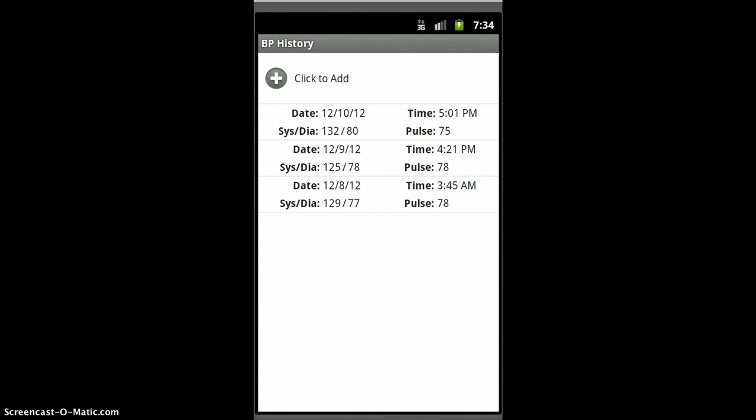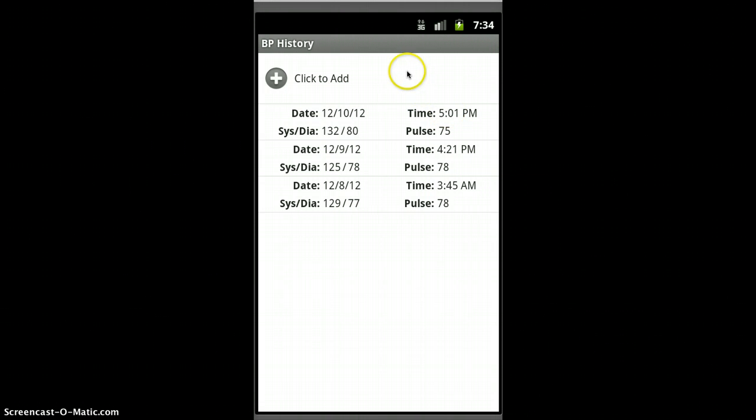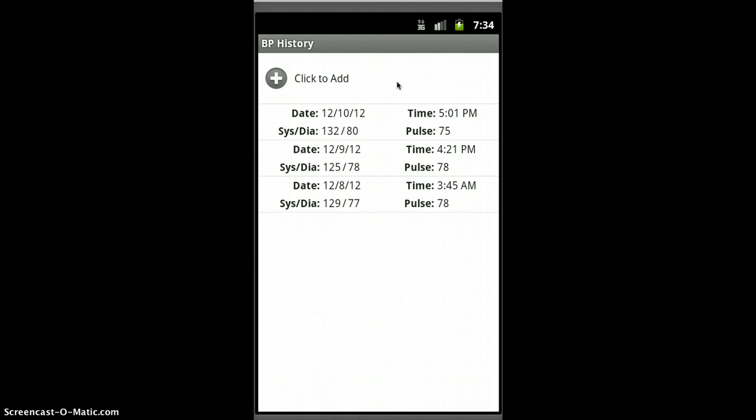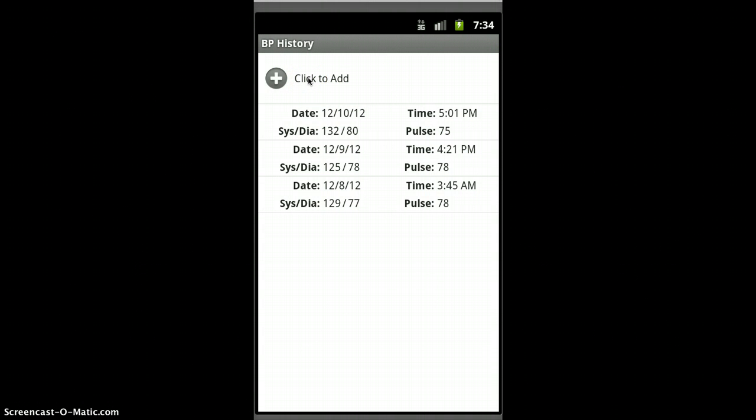Just for those that are new, BP Tracker Free is a way that when you take your blood pressure, you can record it and then later send it to your doctor or yourself. When you first bring it up, it would be empty, but here I've got some fake readings that I put in just for the demo.